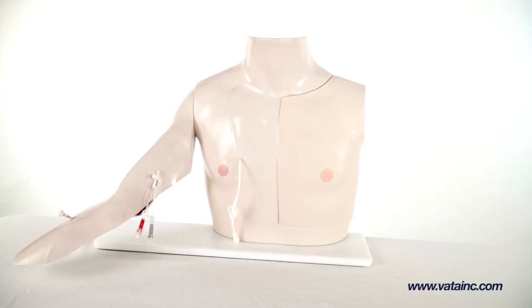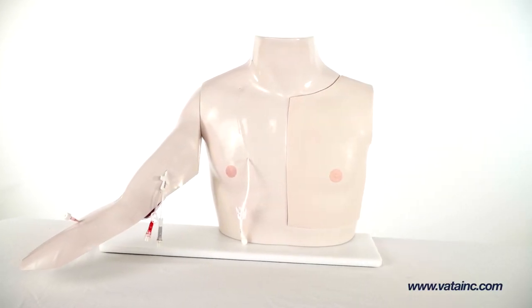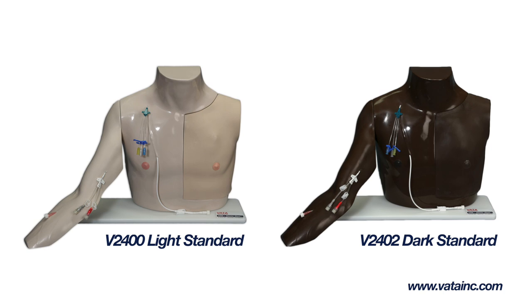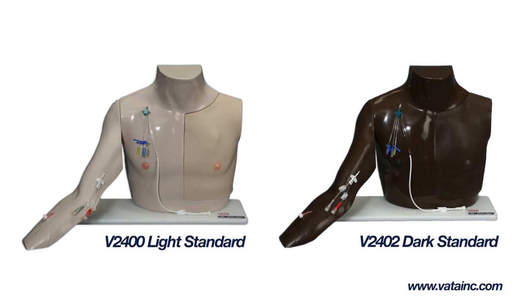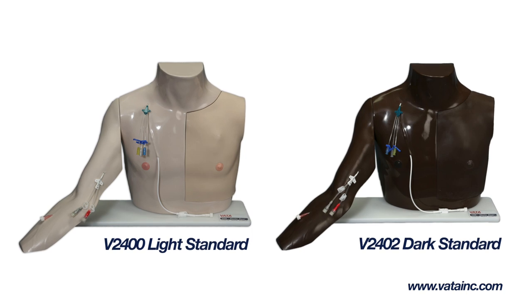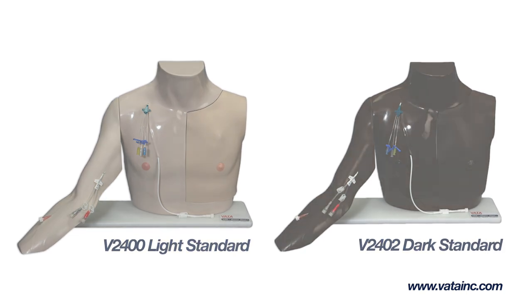Vata's Chester Chest has been an industry standard in the teaching of central line care since Vata's start in 1987. Available in both light and dark pigments, Chester Chest enables physicians, nurses, and patients to develop competence with the most common types of vascular access devices.